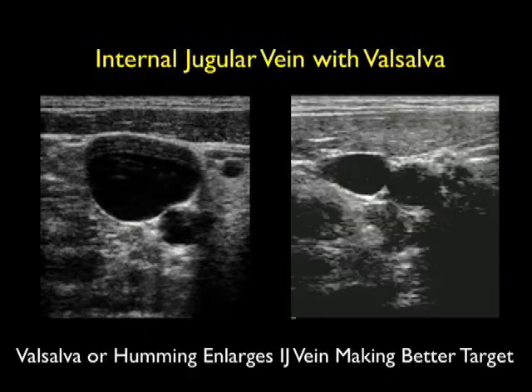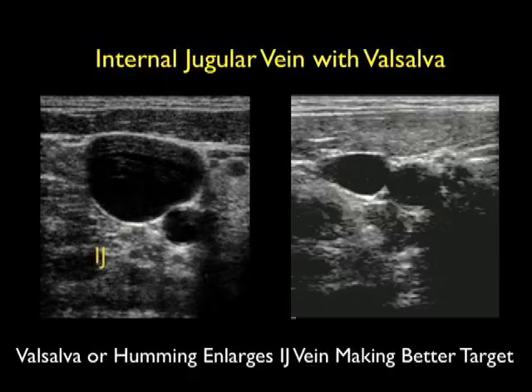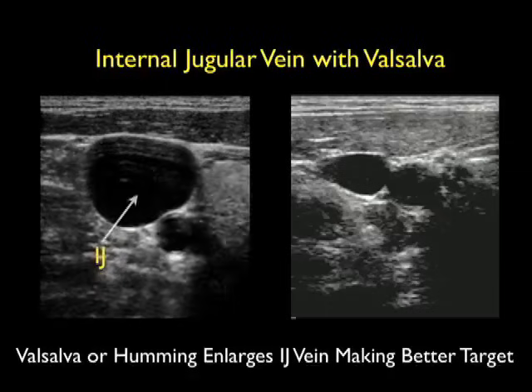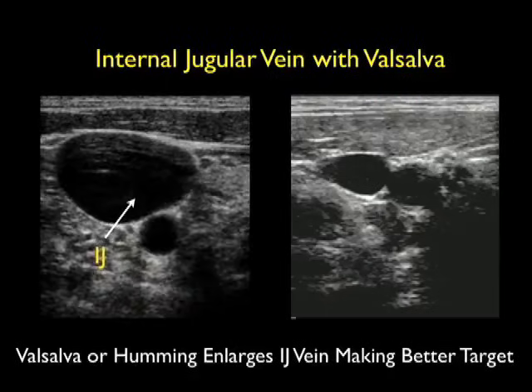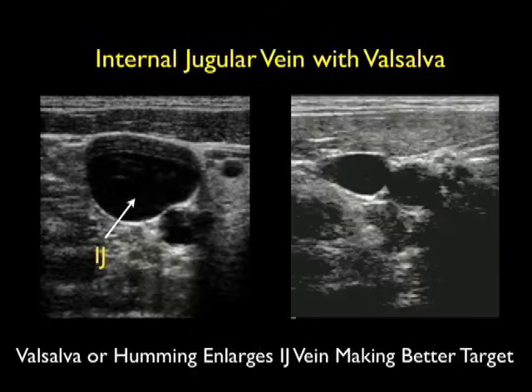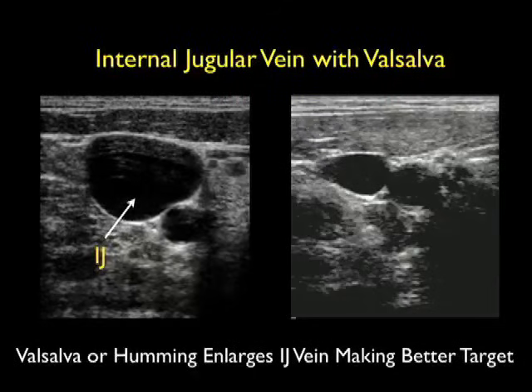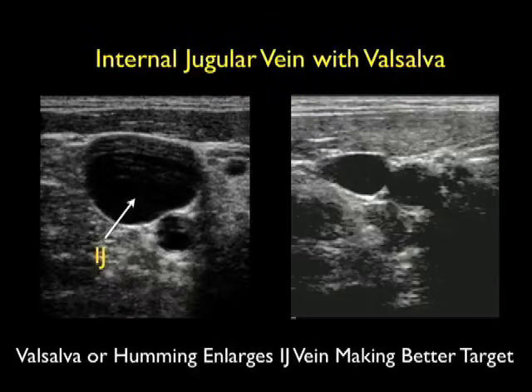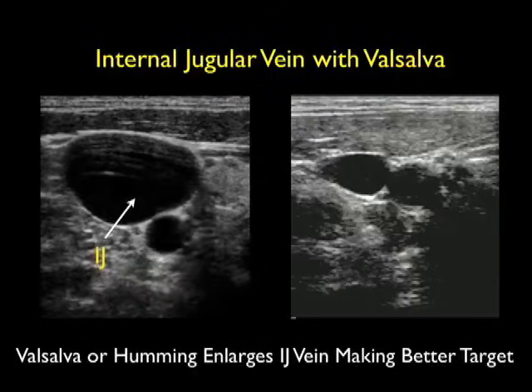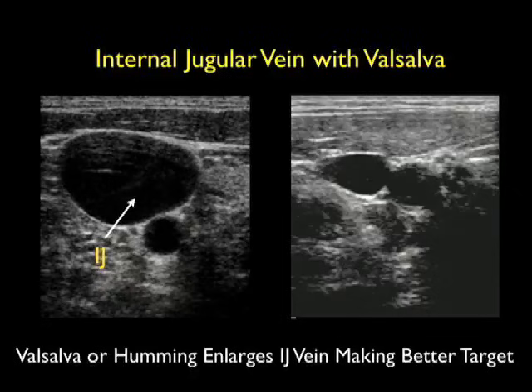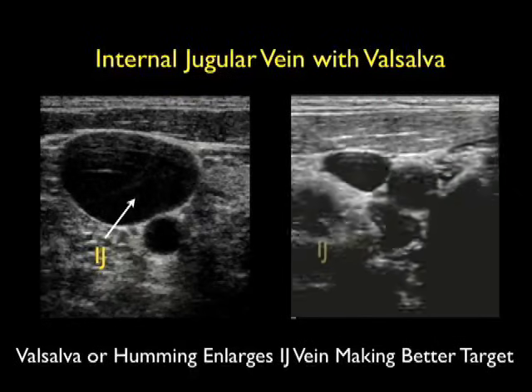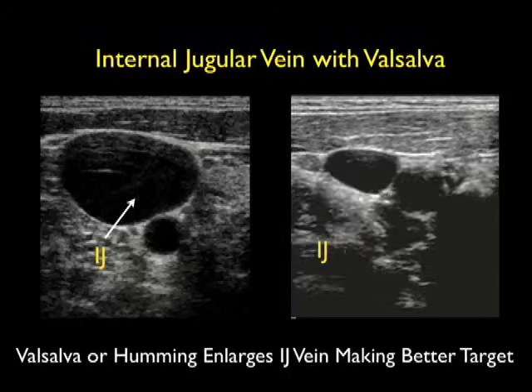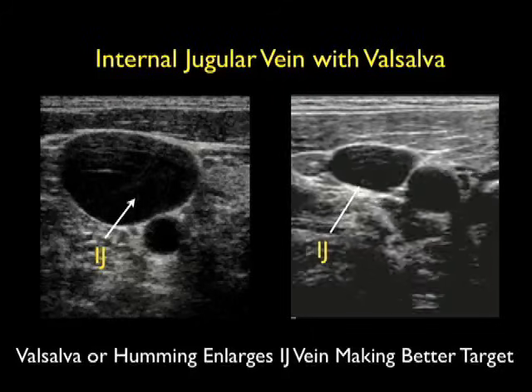One pearl that can be used to further distend the internal jugular vein and make it a better target for a cannulation attempt is to have the patient valsalva or hum. Notice here in the image to the left the patient is bearing down, and notice that the internal jugular vein becomes much bigger as the patient pushes down.